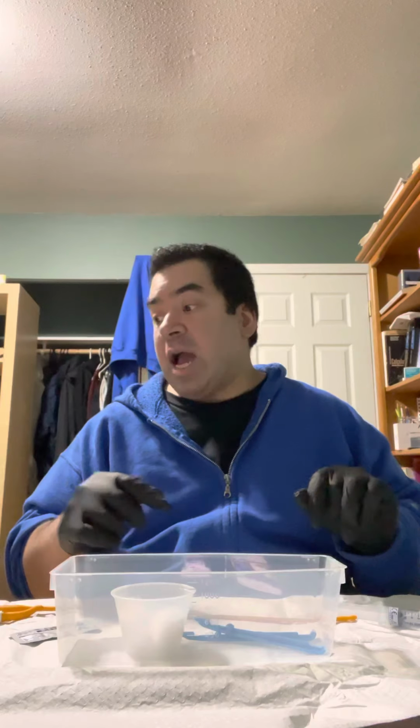I will secure the catheter with a strap. I will attach the securement device just at the catheter bifurcation, securing the tubing to the patient's inner thigh. I will attach the drainage bag to the patient's bed frame from below, making sure it's below his bladder. I'll make sure the urine flow is unobstructed.